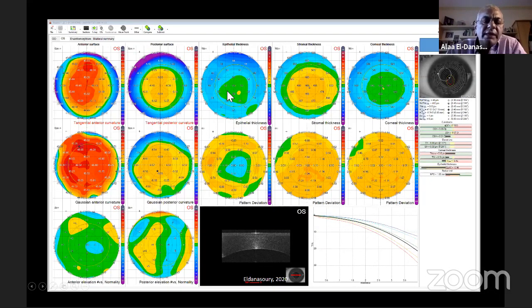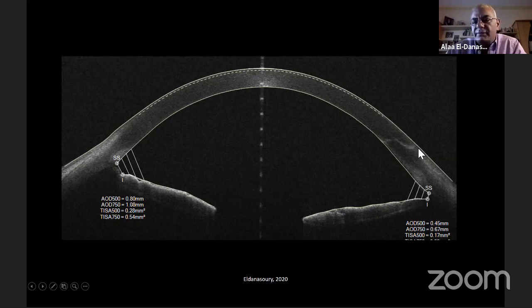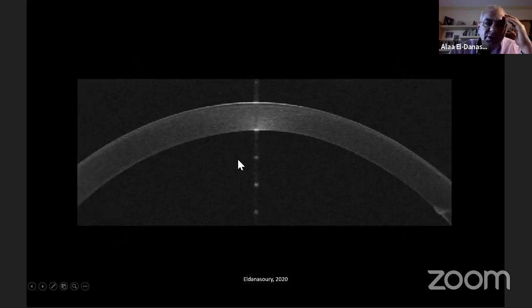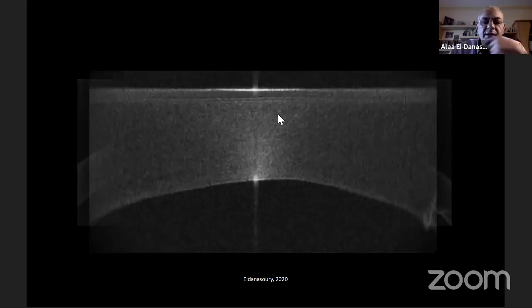Also, having the anterior segment OCT with good resolution, you can look at the angle, at scleral spur, as Erik just mentioned before. You can even see the wound of your cataract surgery. If you want to look specifically at the cornea, like in corneal dystrophies or degeneration, then you have high resolution corneal images. And this is the applanated cornea. As I mentioned, you can see the epithelium very clearly, the Bowman's layer, and you can also see the posterior surface if it shows a little bit of asymmetry like in this case.